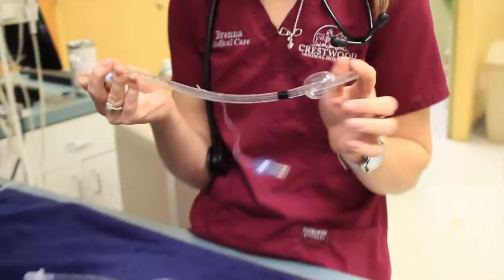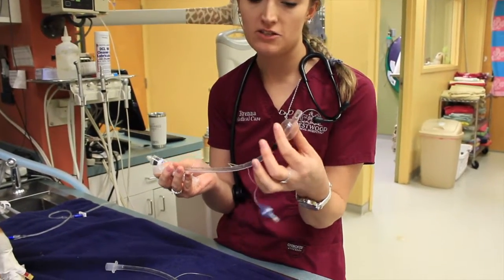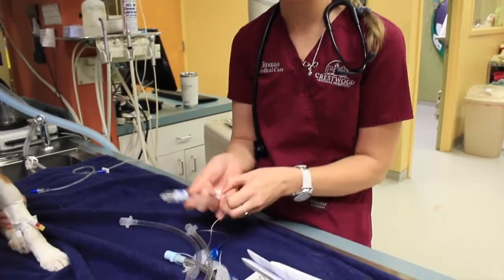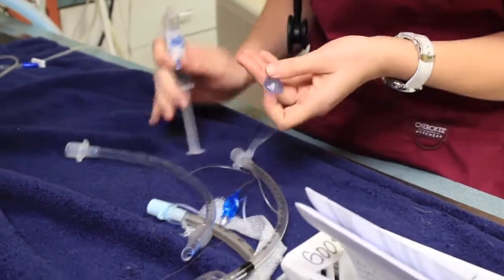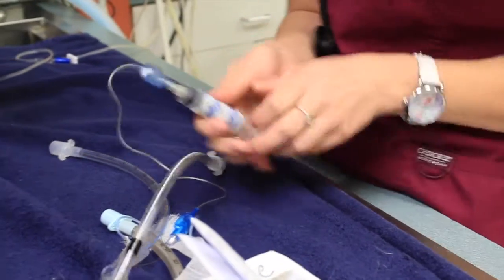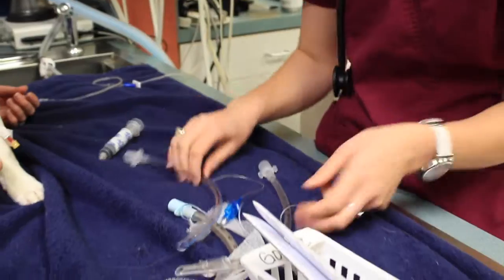These are intubation tubes, or ET tubes. Basically what I'm doing is blowing up this balloon to make sure that they're going to hold pressure throughout the entire procedure. We pick a size that's going to fit each patient, and that just keeps the airway open so that we can make sure they're getting the right amount of anesthesia and oxygen throughout the procedure.